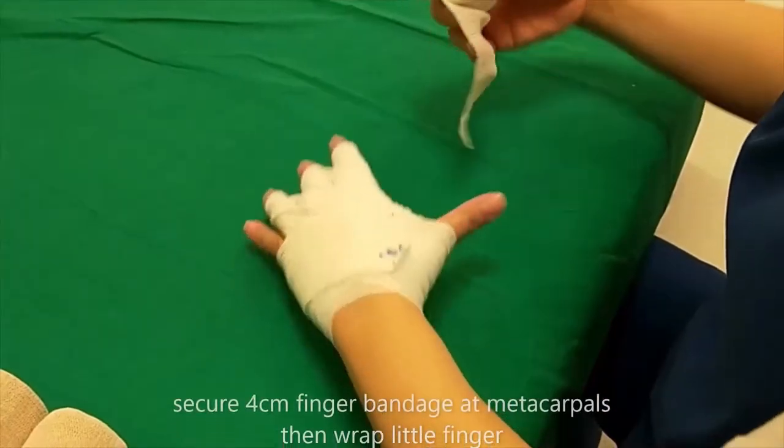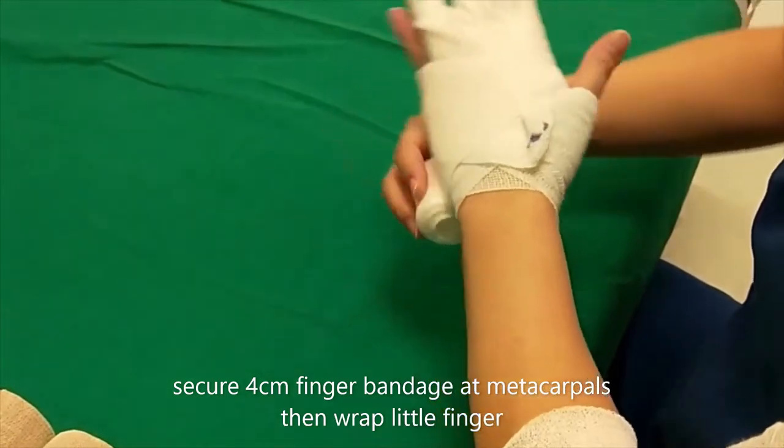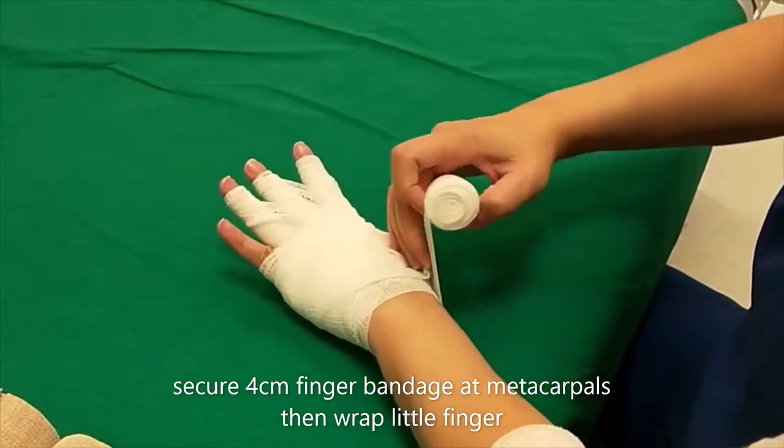Now take a 4cm gauze. Fix it at the metacarpals and continue to wrap the little finger 3 or 4 times.